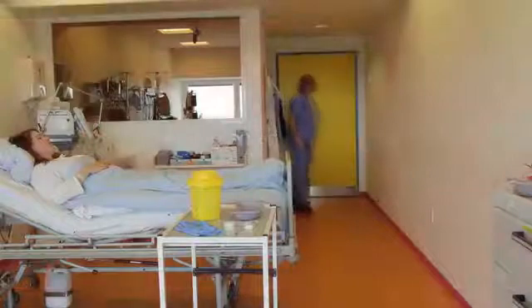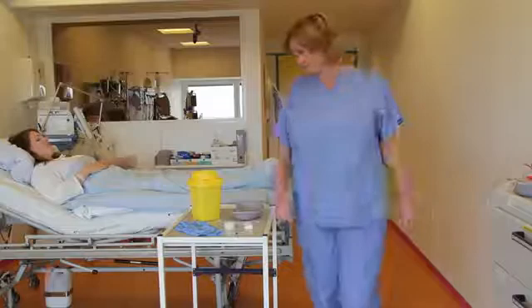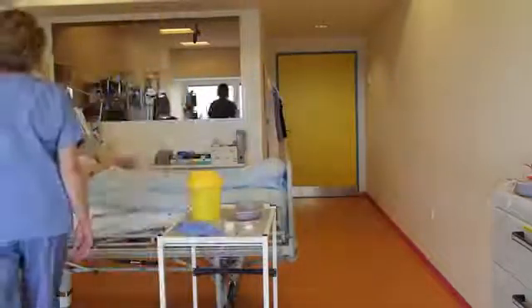This is an instructional video about how to perform an arterial puncture. When sampling, be sure to always follow your hospital's procedures.